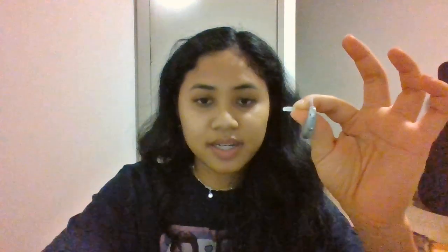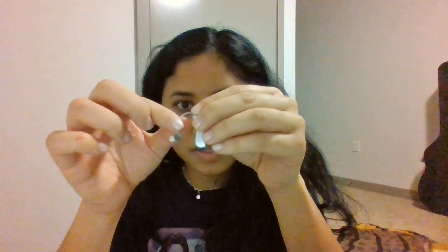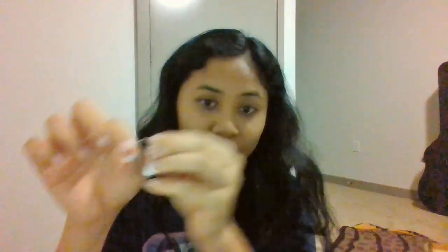When that's in, go ahead and put your power dome back on. So those are the physical properties of your hearing aid and how to clean each piece: your volume button, your microphones that need brushing every now and then, a slim tube where your sound goes that might need replacing, and your earwax trap behind the dome that you replace. And then you also have your power dome on top.